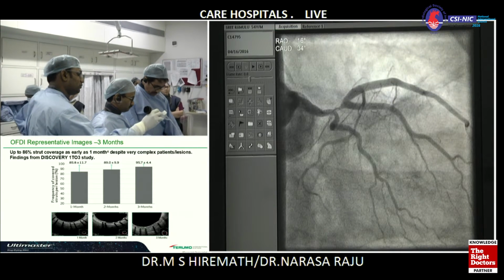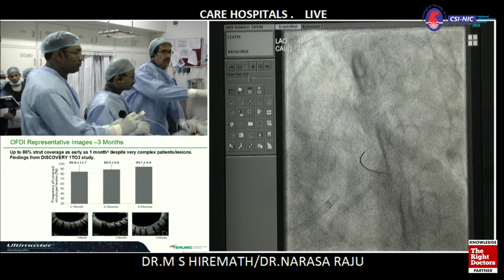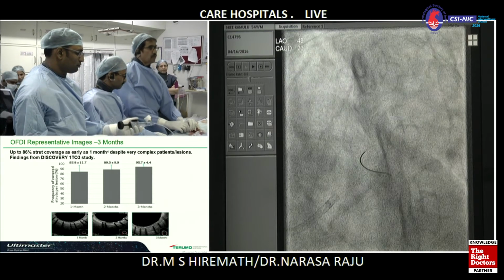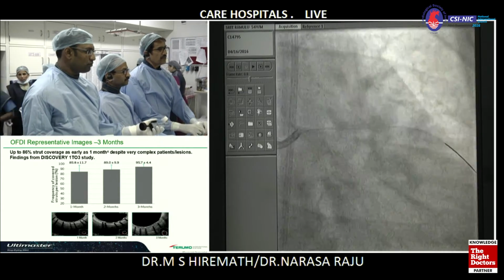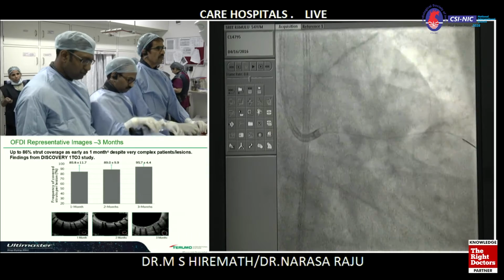This is Rajiv Lochan. What's the length you have chosen, and what's the diameter of the stent? So we have 4 into 24. The IVUS actually indicated the length of the lesion was 17. So we have enough length on either side.